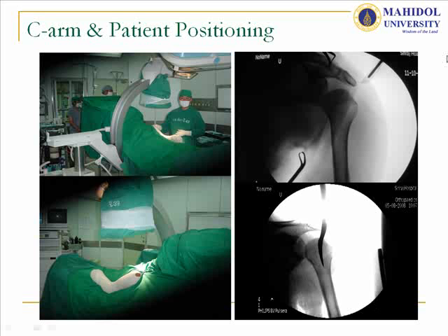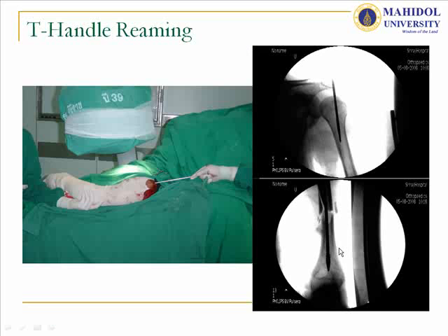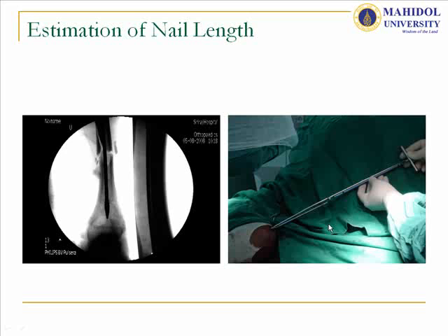For our technique, we place the patient in the beach chair position with a small wound just lateral to the acromion and minimal penetration using a small reamer. We use a T-handle reamer to create the passage because the humeral shaft has no straight canal. We use a flexible reamer starting from 6 mm to create the passage for nail insertion, reaching the supracondylar area just above the olecranon fossa, then ream up to 7 mm to accept the 6.7 mm unlocked humeral nail. We measure the required length using another T-reamer of equal length to guarantee proper length and diameter.